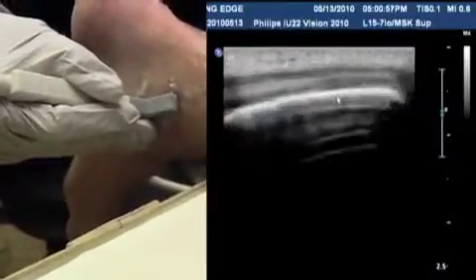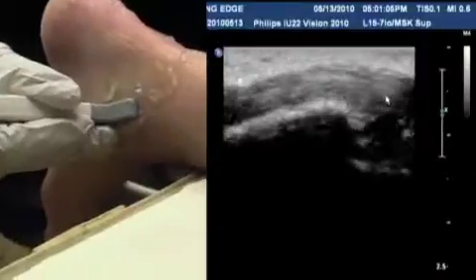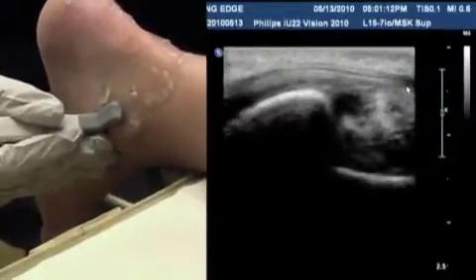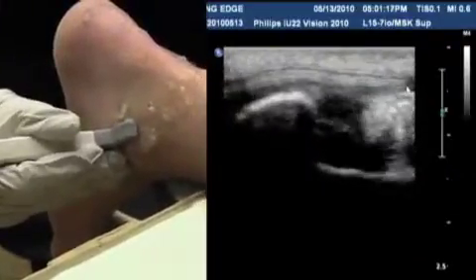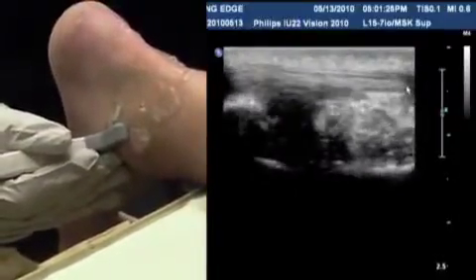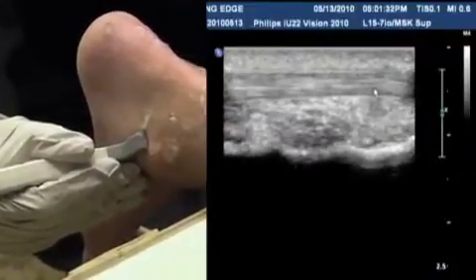What's going to happen as you slide down, you're going to have the ankle or medial malleolus of the ankle where the tendon starts to curve down. And as it's curving down, you can follow this tendon. Most of the time, we do not follow the tendon unless there's a pathology, but for posterior tibial, it's usually important to make sure that you follow it, because you do find a lot of pathology within the posterior tibial tendon. And what happens with this tendon, it goes and inserts onto the navicular bone, which is on the medial aspect. So there's the distal portion of the posterior tibial tendon.